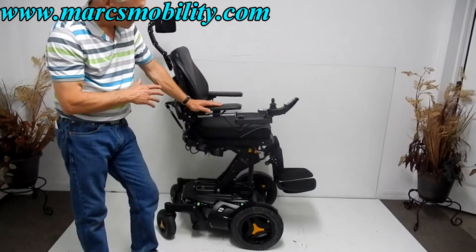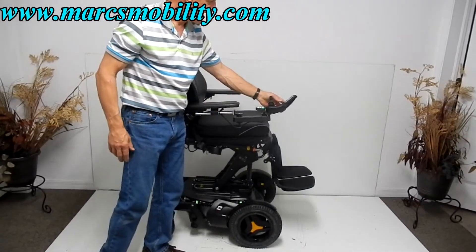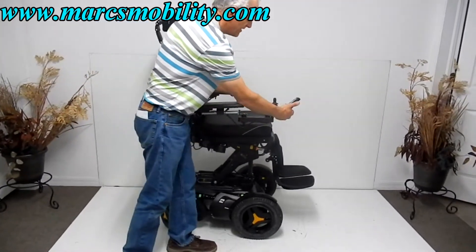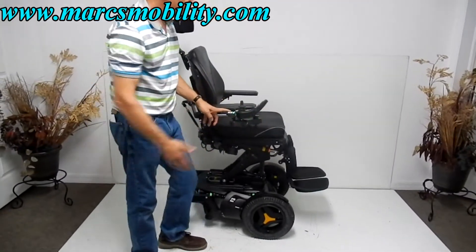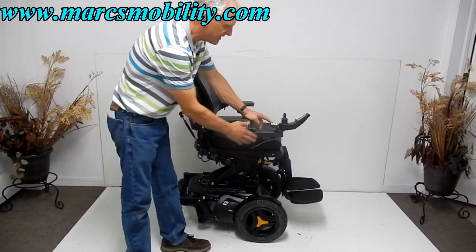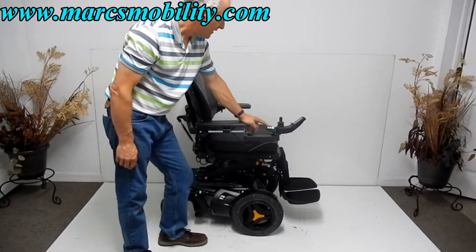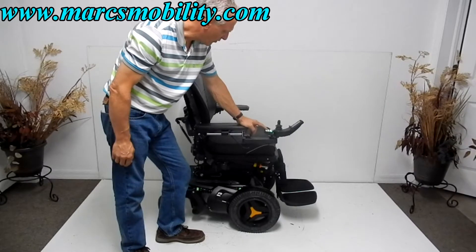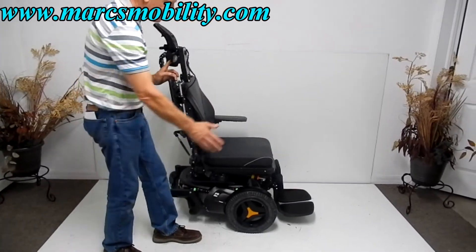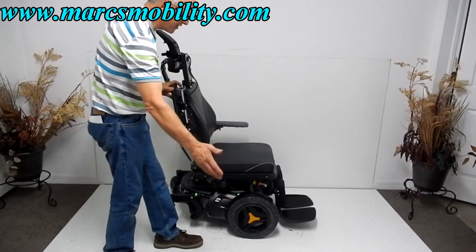So now we've demonstrated the 12-inch seat lift. I'm going to put it back down. This chair also has a nice swing-away joystick. You can swing it from the front to the side very easily, and it can be put on the right or transferred to the left depending on whether you're right-handed or left-handed. The arms also flip up for easy access, so you can get in this way if you're transferring with a board.